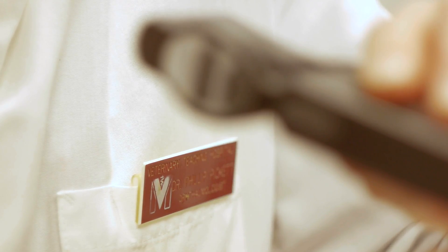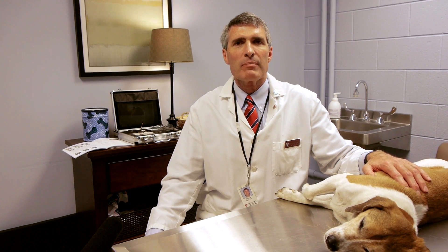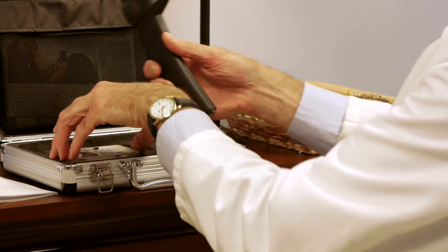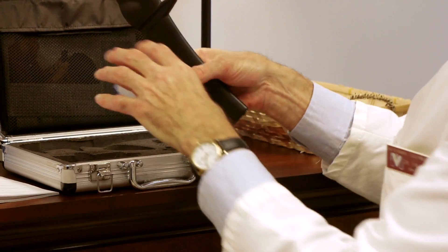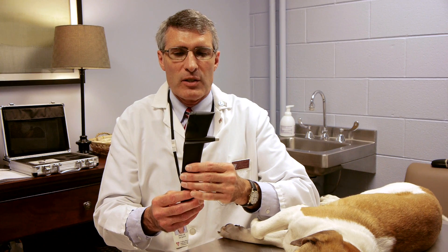This morning I would like to demonstrate the use of the iCare rebound tonometer used in the dog. This is an instrument used to measure intraocular pressure in animals. This is the Tonovet rebound tonometer, made in Finland by iCare and distributed by Jorvet here in the United States.